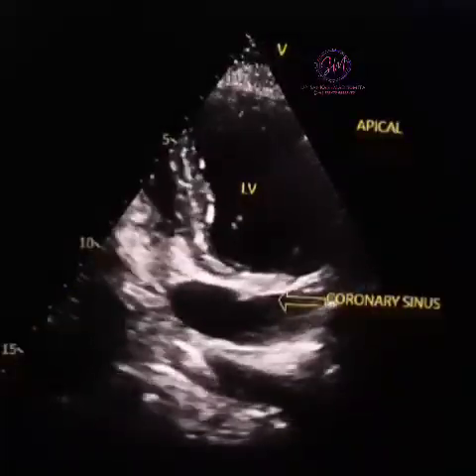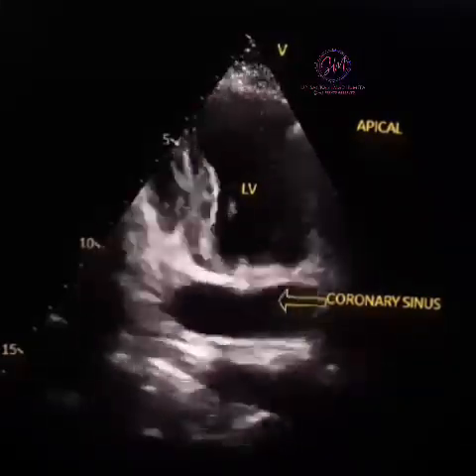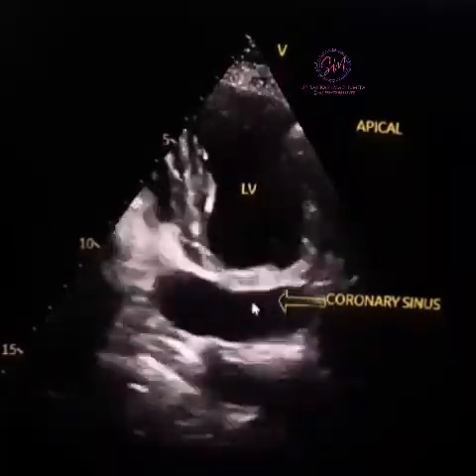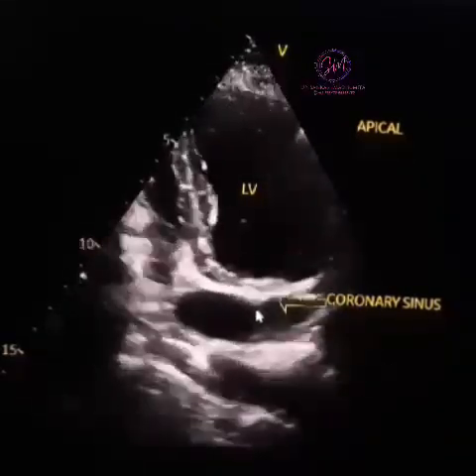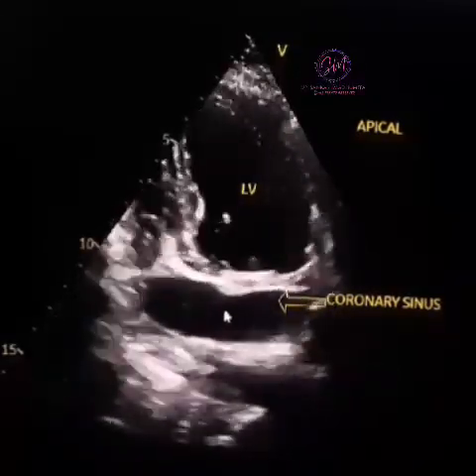A modified view of apical structures where you can see the LV apex, and with a little posterior tilting of the transducer, you will be able to see the dilated coronary sinus which is going into the right atrium.